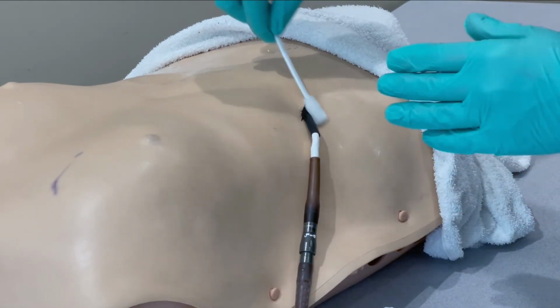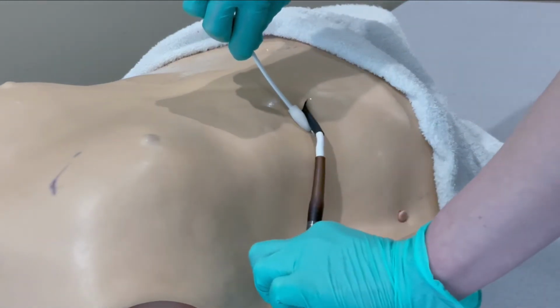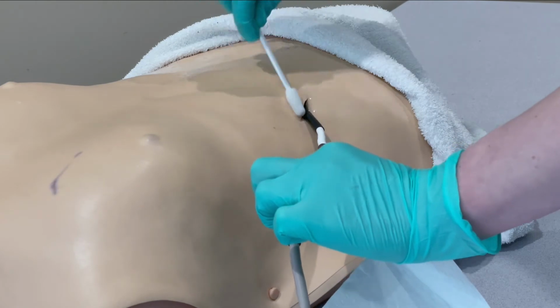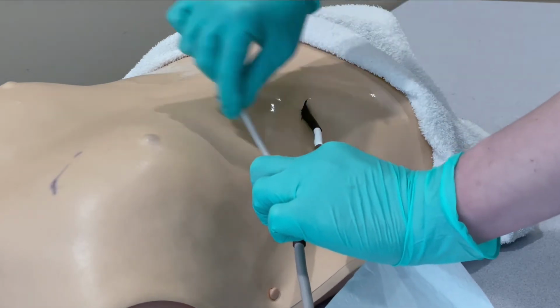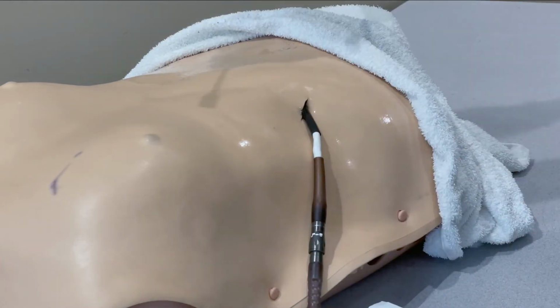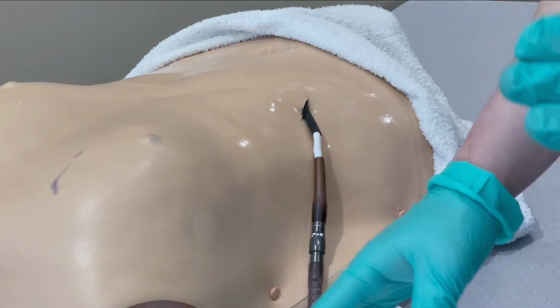Starting from the inside. And if you need to use your second hand to lift your driveline up to get underneath, that is okay. Just keep in mind that this is now your clean glove hand while this is your sterile glove hand. You're going to go all the way out. All right, now while that dries, we can continue down our road of items.